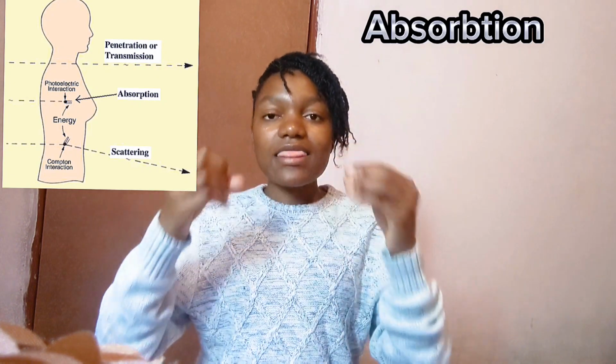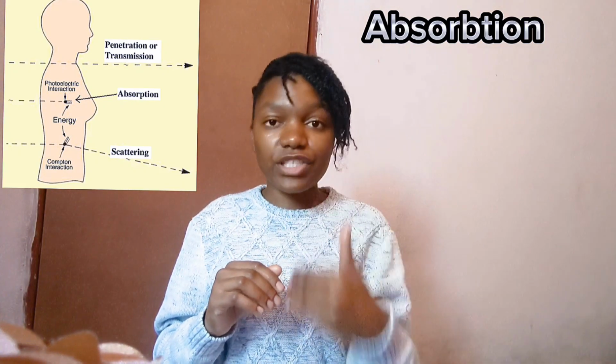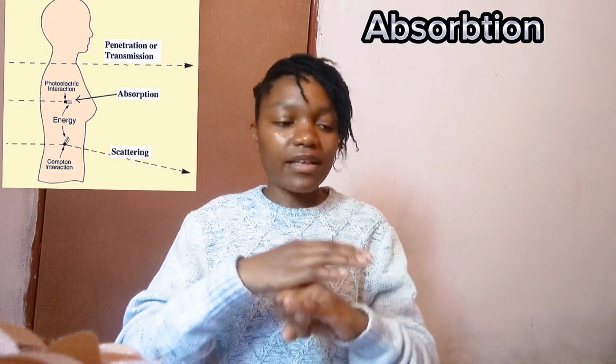That's about the absorption. I'm going to share with you how it looks on the image, but for now let me just explain these three things which happen in the patient's body. So the absorption is done. The photon will give out its energy to the atom, and end of the story for that.